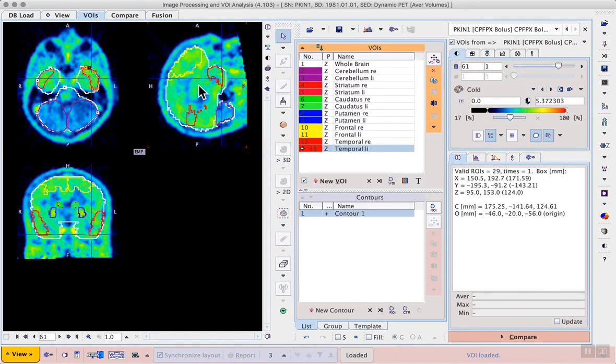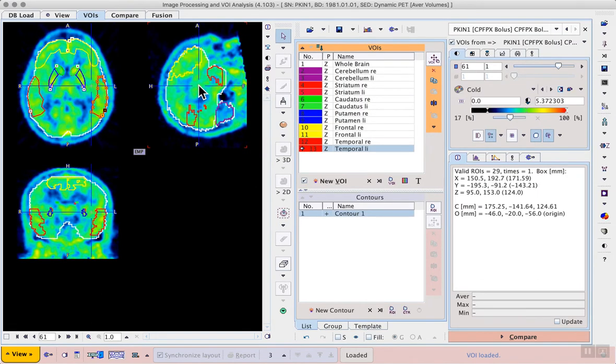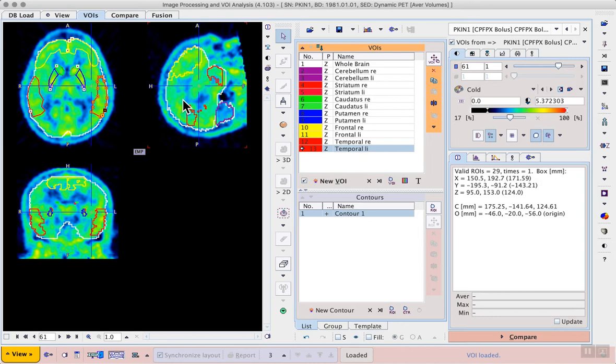When they're overlaid on the average image we can see that they correspond well to the overall anatomy, which means they'll be good enough to extract time activity curves. To get those curves we switch back to the dynamic data using the list in the top right.